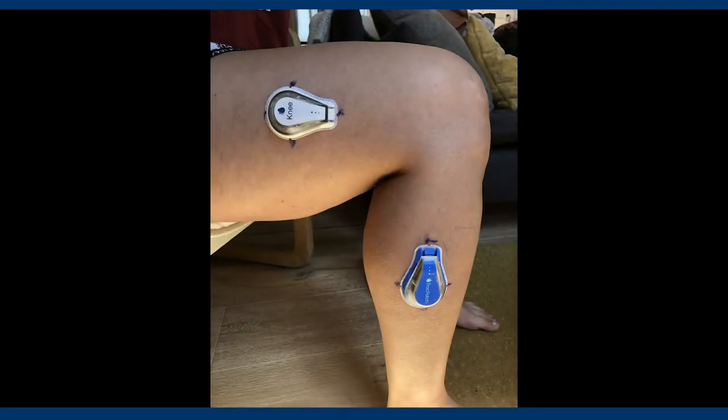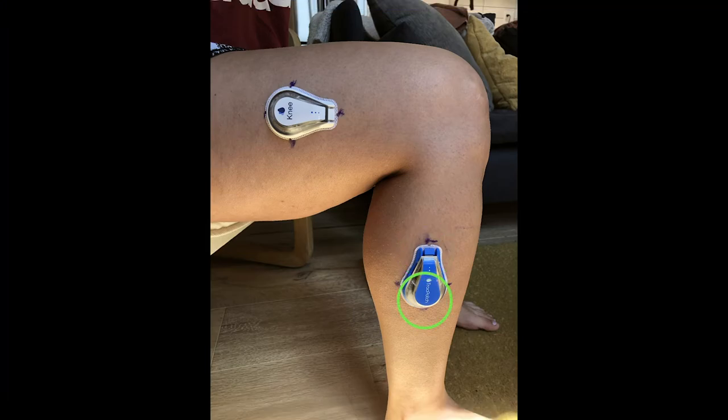For the blue ADP replacement, the narrow portion of the ADP will always be pointing towards your knee, and the wide portion of the ADP will always be pointing towards your hip.